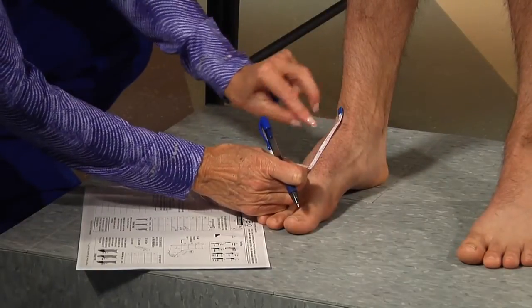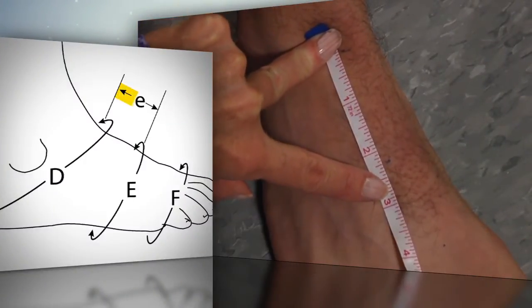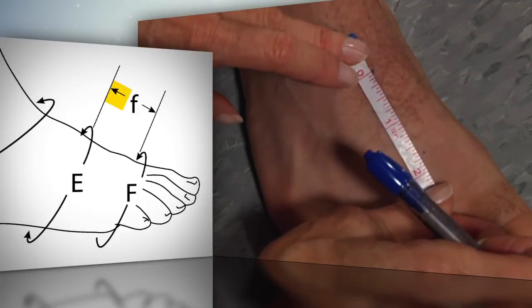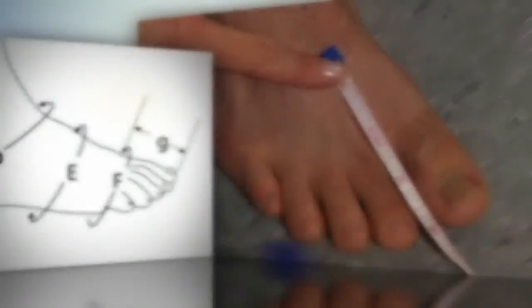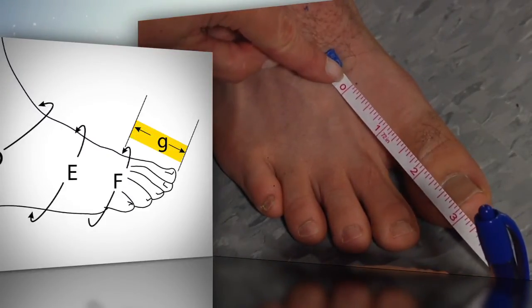You can use the retractable tape or a clear ruler for distance measurements. The measurement little e is the distance between circumference measurements capital D and capital E. The little f measurement is the distance between capital E and capital F. The little g measurement is the distance between circumference measurement capital F and the end of the longest toe.